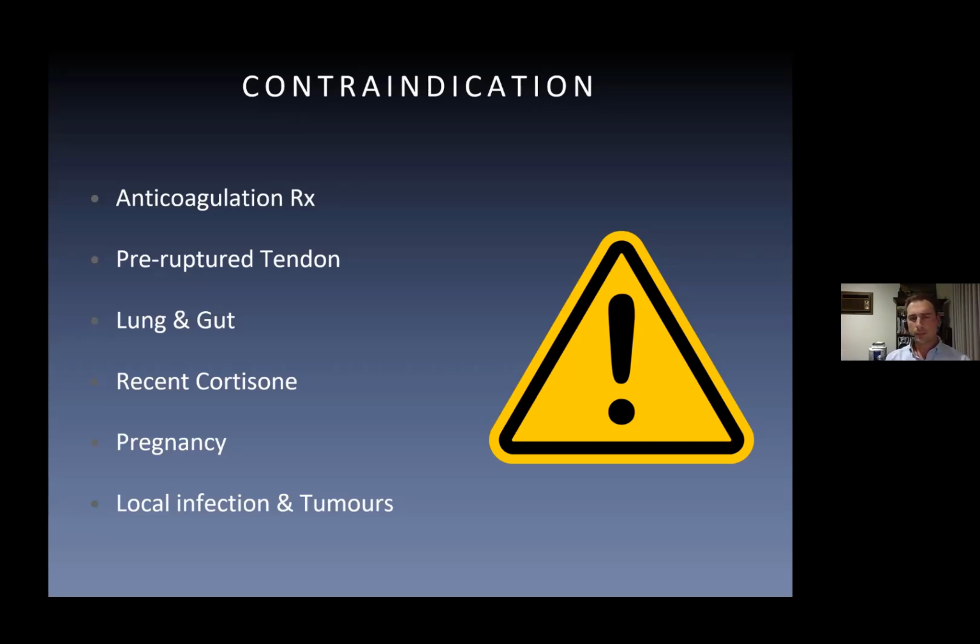Pre-ruptured tendon. This is important, not that shockwave has been shown to cause tendon ruptures, but when you've got that level of tendon damage, often shockwave can be used, but it's all around the timing. You've got to get some cellular healing there first. If you've got fluid, shockwave can't act on fluid. So if you've got a decent intrasubstance tear in a tendon, there's no point shockwaving that right now. You need some fill-in of scar tissue, a scaffold for those cells to work off.